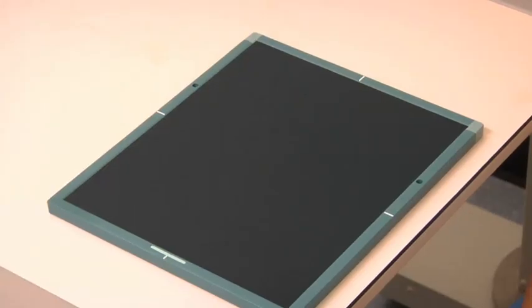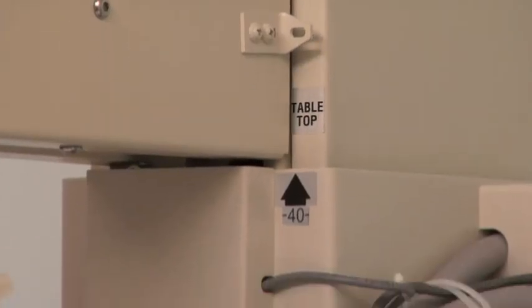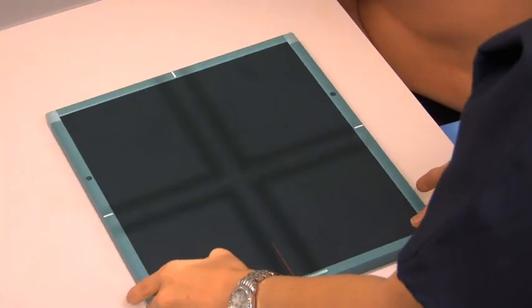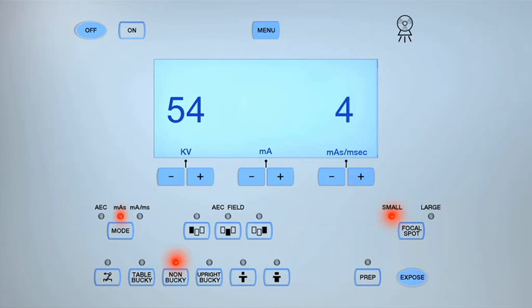To obtain a radiograph of the second finger in the PA projection, select an 8 by 10 inch cassette and place it on the table. Set the source to image receptor distance, or SID, to 40 inches. Turn on the collimation light and align the central ray to the center of the cassette. Select the non-bucky setting and the small focal spot on the control panel. Set the exposure parameters to between 50 and 55 kilovolts (kV) and between 2 and 4 milliampere seconds (MAS).